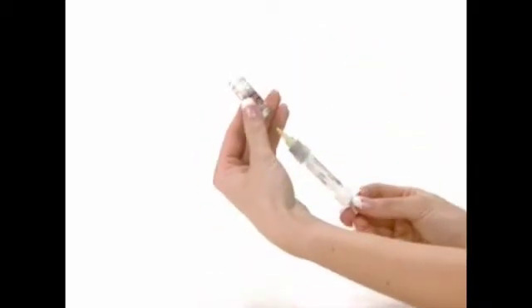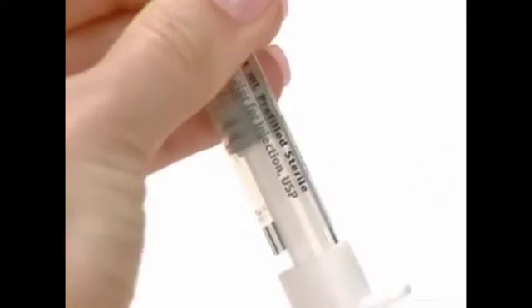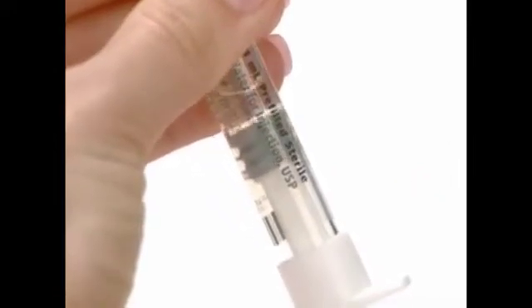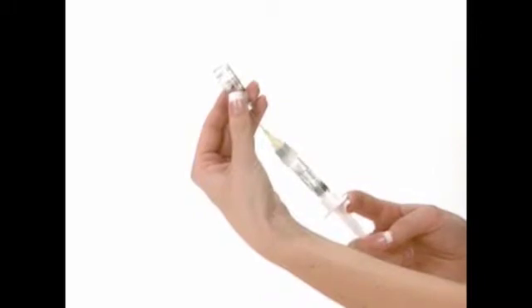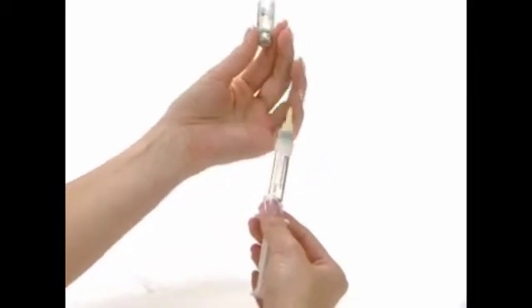Keep the needle in the vial as you lift the vial and turn it upside down with the needle pointing upward. Slowly pull back the plunger until the syringe fills with the total contents of the vial. Carefully remove the syringe needle from the vial.